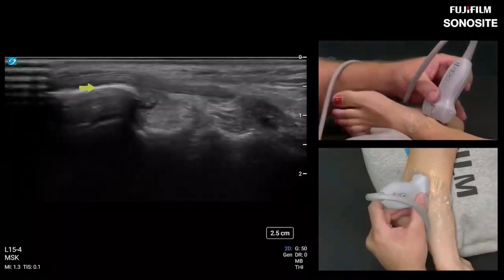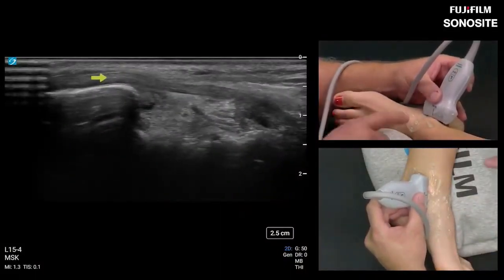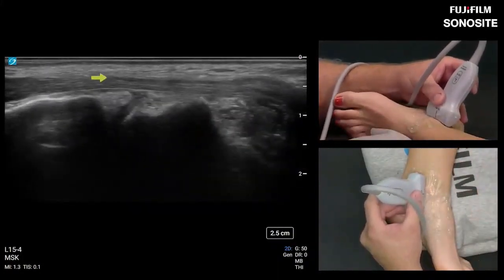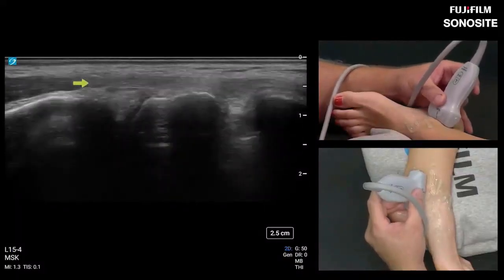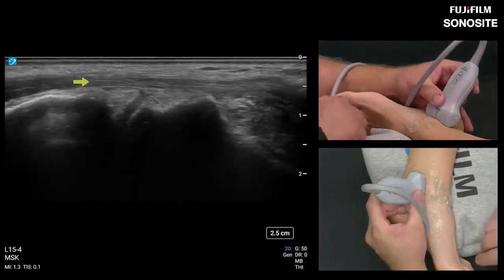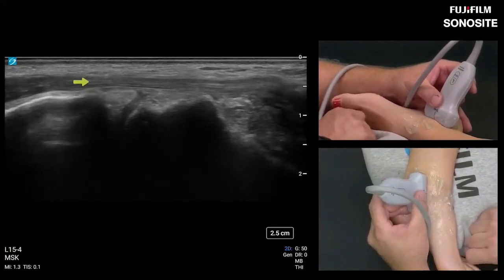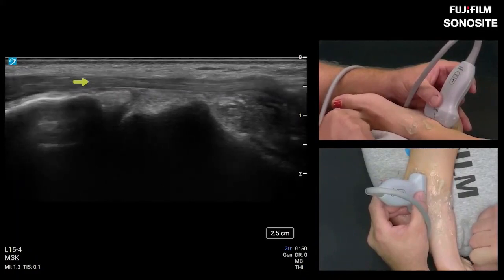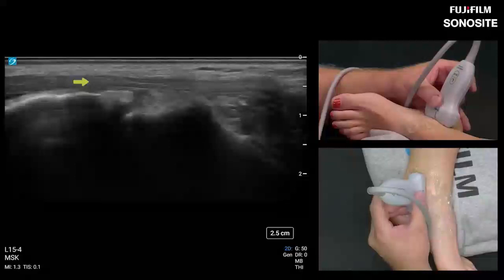All right. So now I'm going to fall posterior to the tibialis posterior tendon, just immediately posterior to that. There's another tendon right here. And just to double check our work, that this is the flexor digitorum longus, which we know goes to the digits, I'm just going to wiggle passively the toes. So I'm just going to start on the second toe, third, fourth, fifth, and just make sure that's the tendon group that we're looking for here.